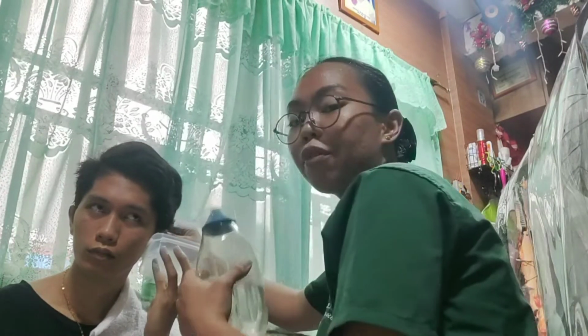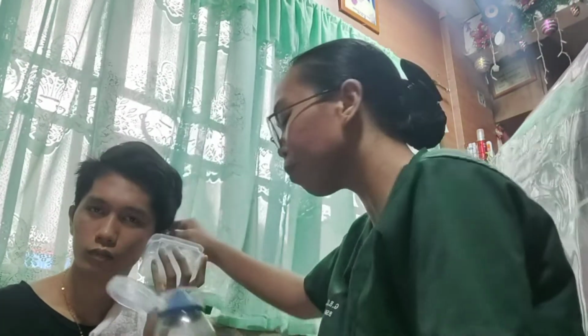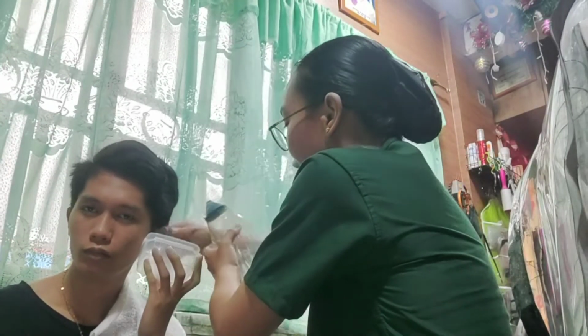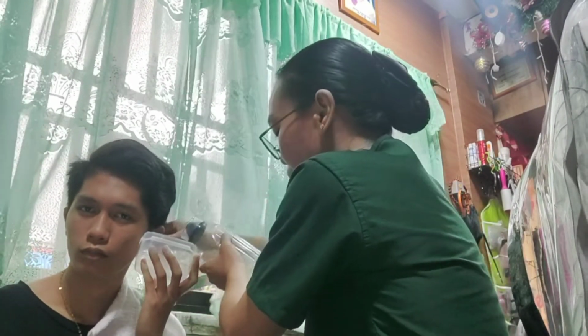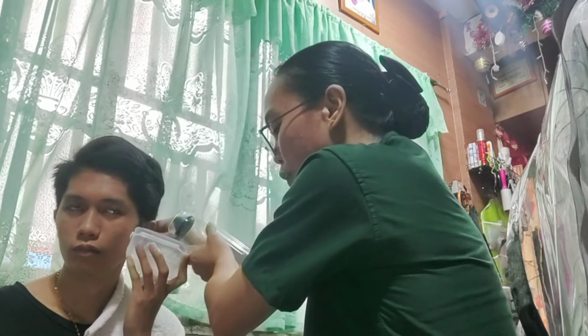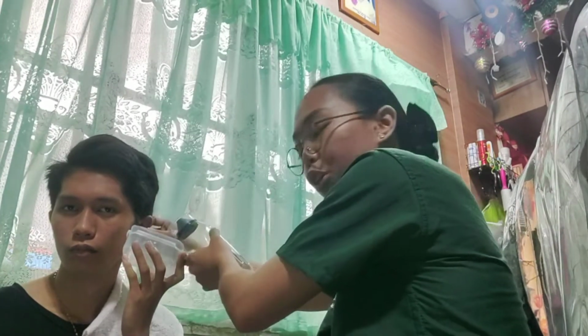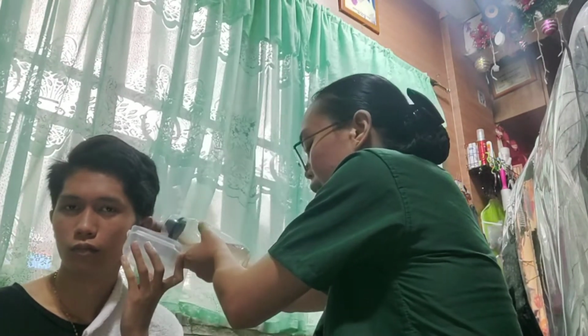Next, place the tip of the syringe or irrigating catheter at the opening of the ear. And next, gently direct the stream of fluid against the sides of the canal to avoid pushing the impacted cerumen inward.